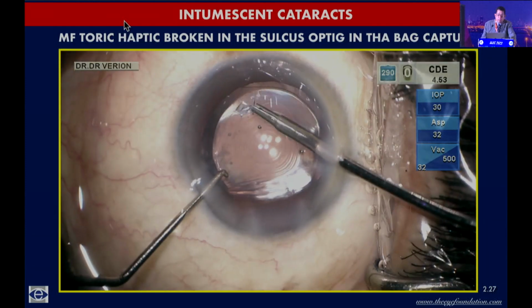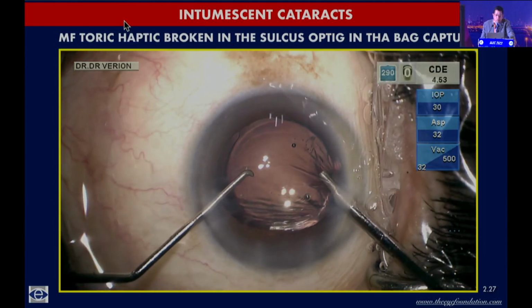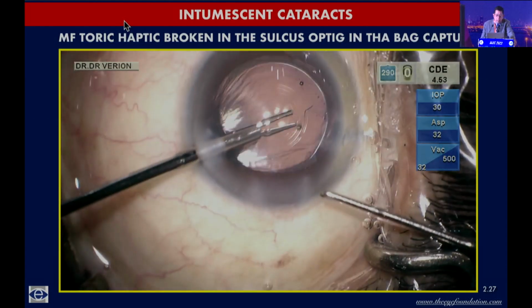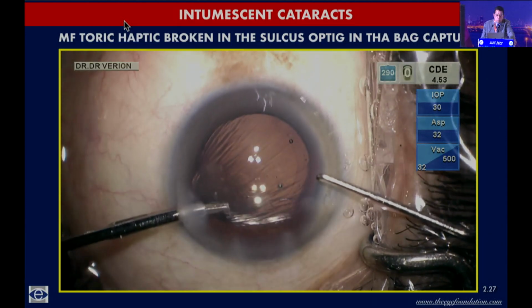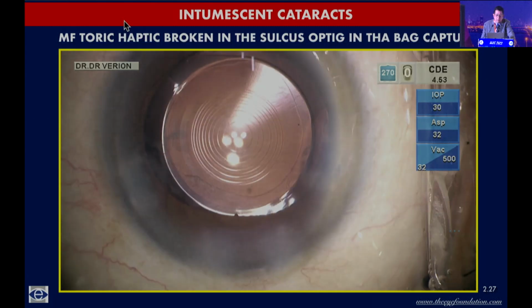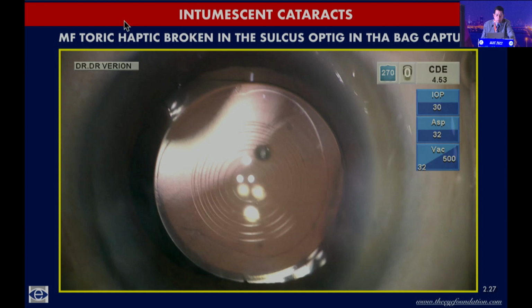It's extremely important that the capsular rhexis remains on top of the optic so that you have all the advantages of posterior capsular opacification prevention. And when I come into the subincisional area, I just go in with my left hand, and I use the Sinskey hook to stabilize the globe and complete the enlargement of the capsular rhexis. That's completed, and I get a reasonably decent rhexis with a fairly mature cataract. Not the best of rhexis, but I'm quite satisfied with it because there is a good overlap of the optic of the lens without any runoff.